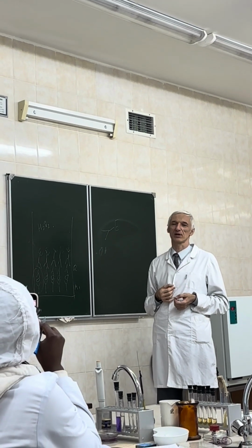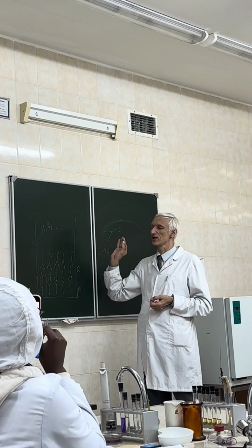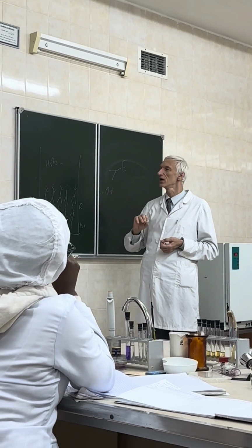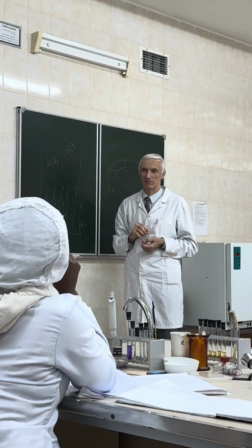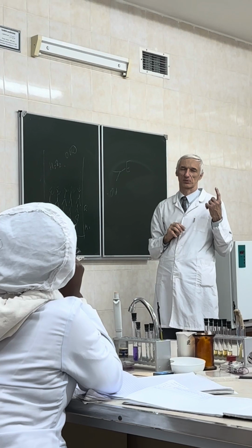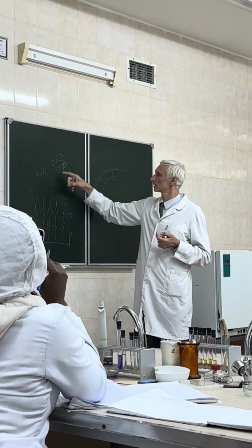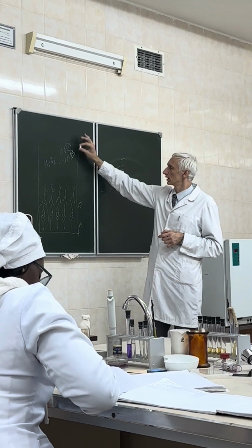It's usually a colorimetric dye. By the way, for peroxidase, due to its very high use in ELISA tests, we now have dozens of indicators. Traditionally the book gives you this one, orthophenylenediamine, OPD. It's very nice, it has only one problem, it's carcinogenic. Nowadays we use tetramethylbenzidine, TMB. It's non-carcinogenic and also gives excellent results for the next detection.